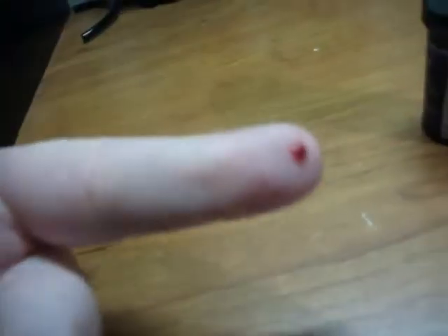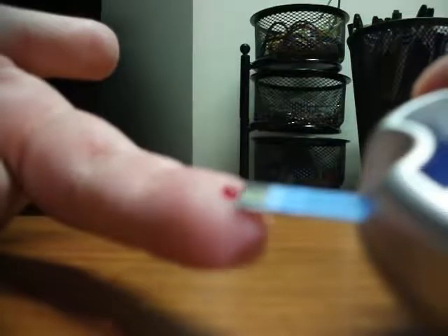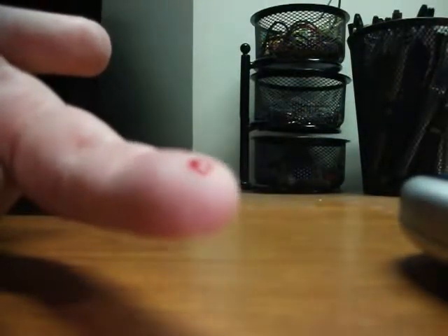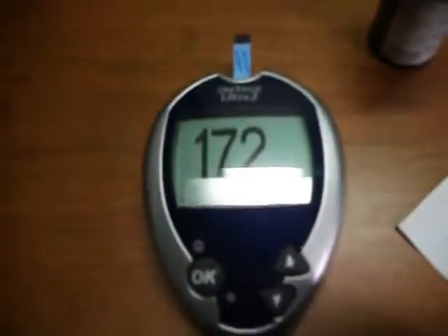Now, this is the sample size that you should have. I am going to take my meter, guide the test strip into the blood, and wait for it to read. I am going to clean my finger off and within seconds you have your reading.